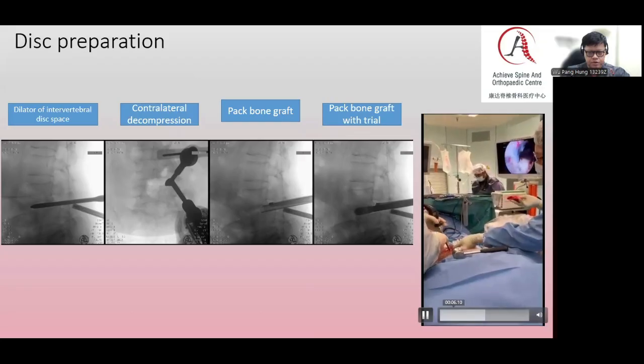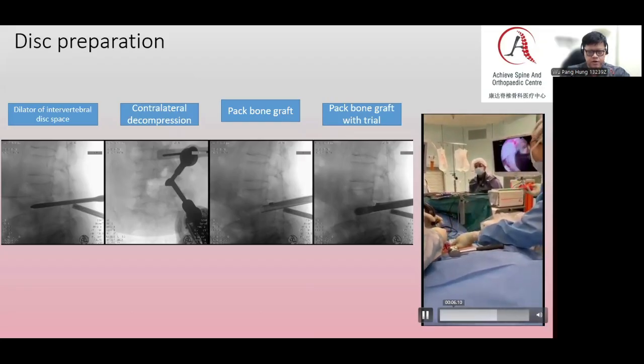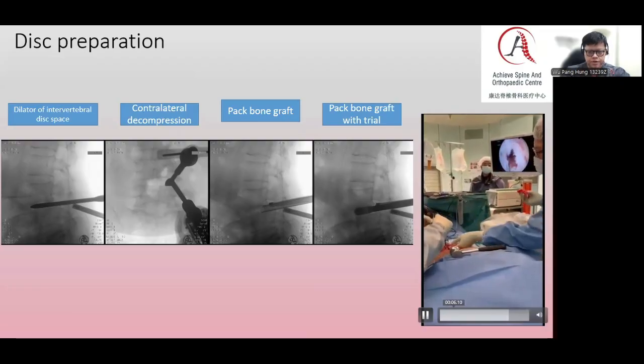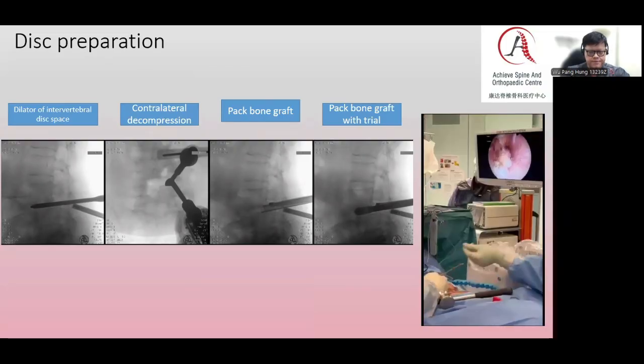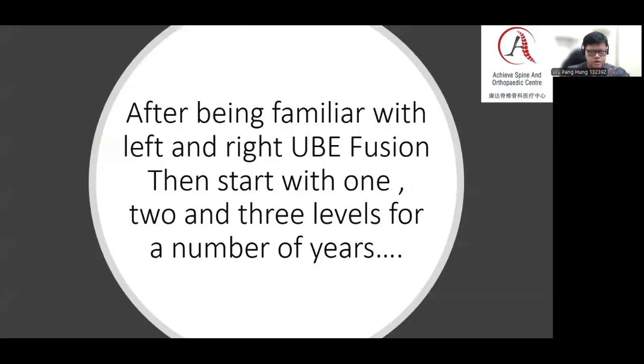Dilators can be inserted, and then also the space thoroughly prepared. I find that using just typical shavers, dilators, and the curette, there's still quite a lot of disc left behind, so we tend to use some blunt instrument before we insert the cage in. So these are some pictures of the cage insertion.